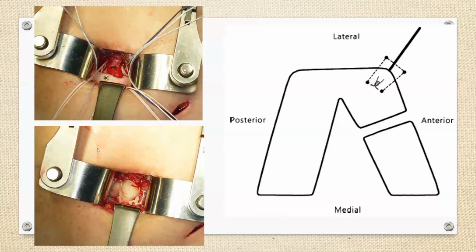Once the footprint is prepared, the cuff can be anchored onto the footprint using sutures. Again, suture configuration depends on the surgeon's preference and the tear morphology. Since this is a very anteriorly placed incision, the LHB tendon can also be visualized by rotating the arm and can also be addressed. While resuturing the deltoid, in addition to suturing the longitudinal split, an additional stitch through a bone hole in the acromion is recommended to secure the fixation of the deltoid.